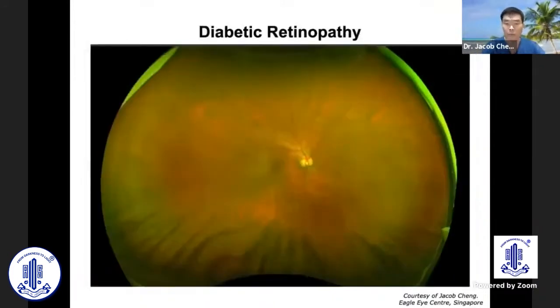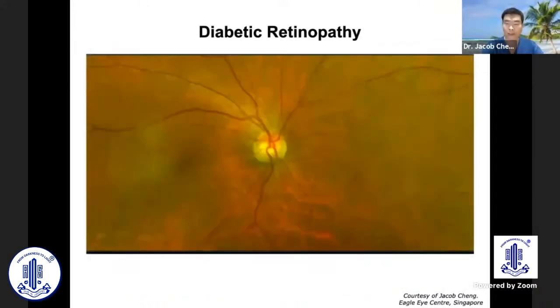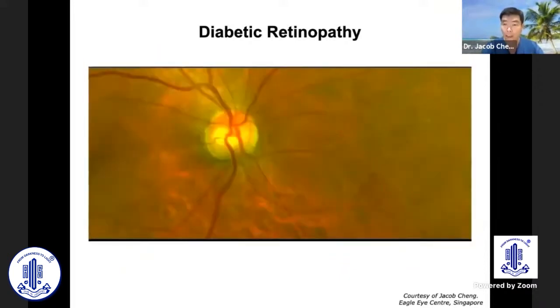But when we go back to the photograph done this time round, we can actually see, on the nasal aspect, a frond of new vessels, despite the almost complete resolution of the peripheral retinopathy lesions. Zooming in on the details of the posterior pole, we can see, highlighted within the red arrows, the details of the frond of new vessels. Here, even with the magnified same view on the Optos, to which I did not do any calibration, you can see that the new vascular frond can be distinctly seen.